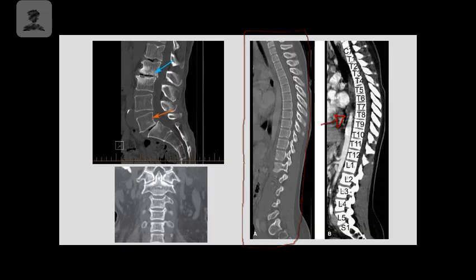And you could look at all of those things, determine, like I said, compression fracture, if there's something compressing the spine, any other type of fractures due to trauma. There's just a lot that you can look for in this area.